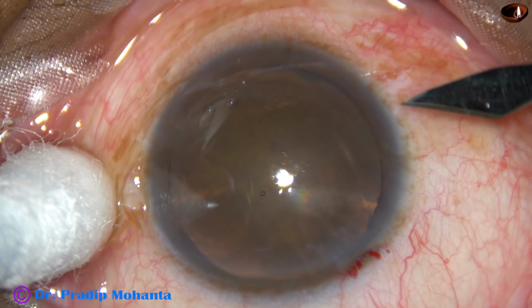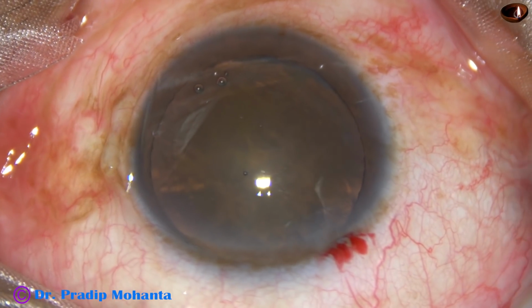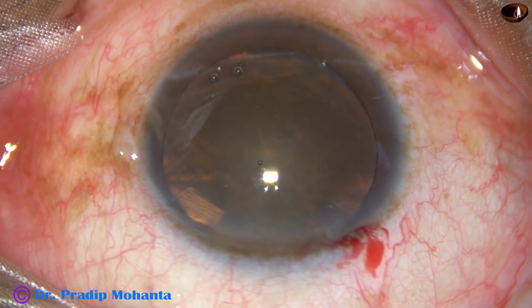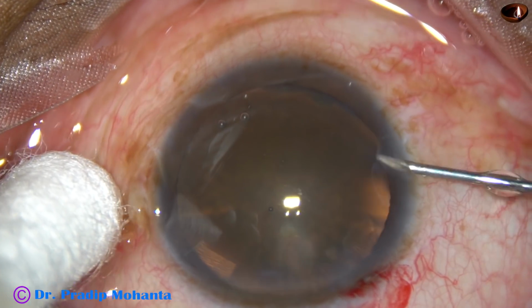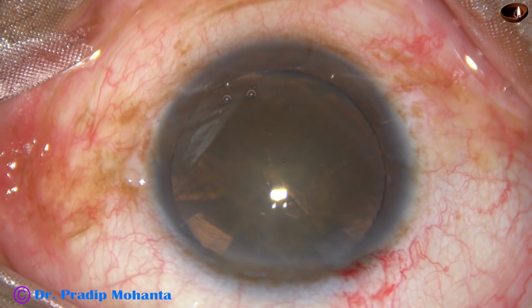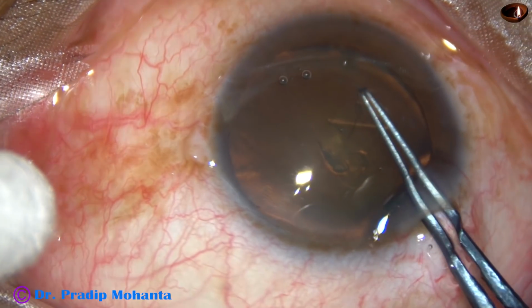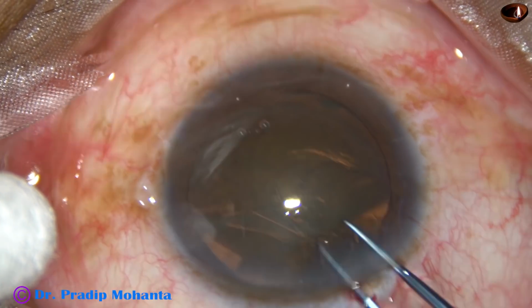In this video, I am going to demonstrate the divide and conquer technique for soft cataracts. In soft cataract, it is very difficult to hold, so in such cases, I usually do the lens tilt technique. In some cases, the carousel technique, and this is another beautiful technique for soft cataracts, the divide and conquer technique. All of us are familiar with the divide and conquer technique, so this can be a universal technique for soft cataracts.